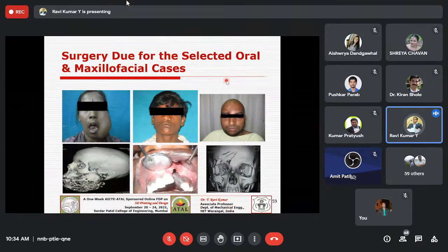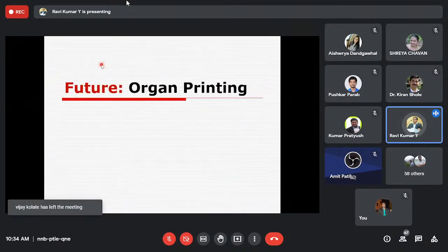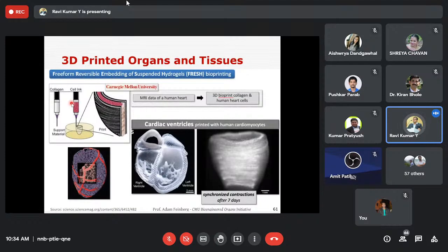So one can understand that while taking up the cases, we need to check the feasibility of these practices using additive manufacturing and 3D printing technology. So far we have been discussing the replacement of bones, or the replacement of joints, predominantly bone replacement. But can the same thing be extended so that an organ can be replaced, transplanted, or repaired? The answer may be yes. In that case, what could be the material? So far we are talking about synthetic or man-made materials, either titanium, or PEEK or PMMA or hydroxyapatite, or any other biocompatible material.